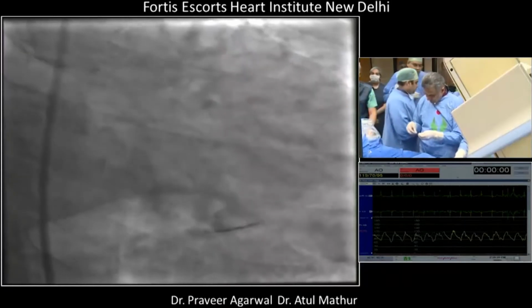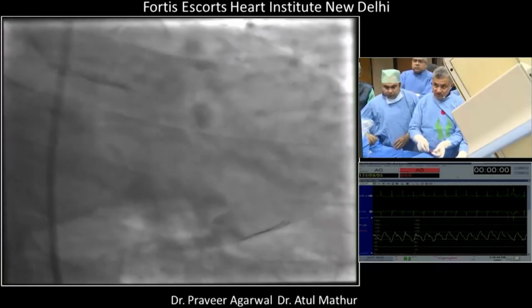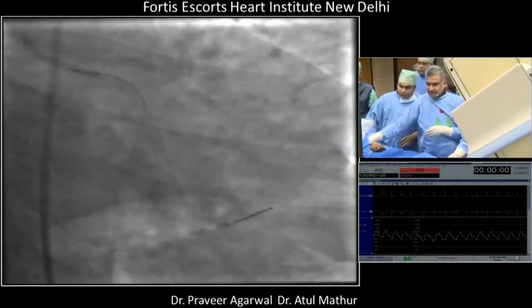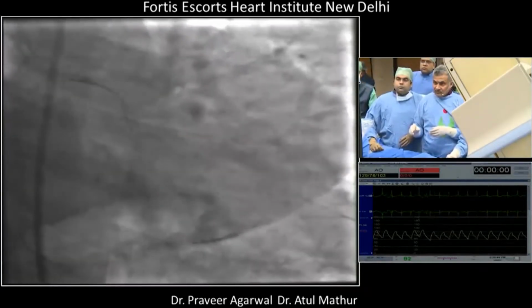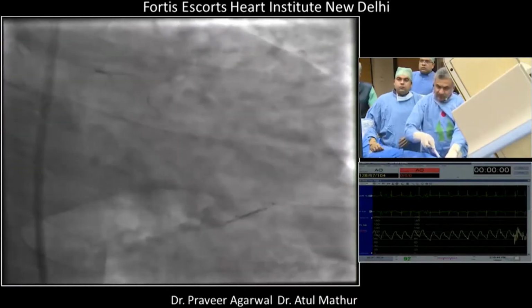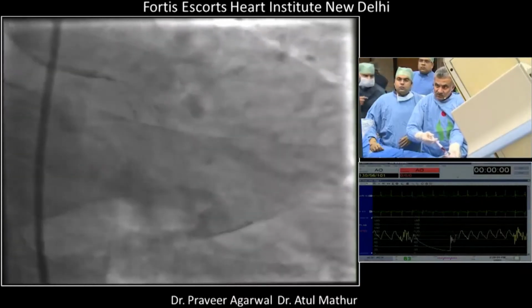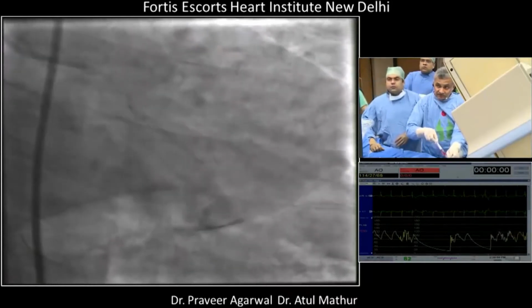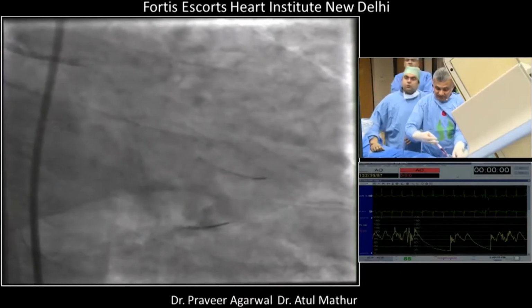Which wire is going to be used to recross the stent? All-Star. Again, All-Star. What wire do you use to recross? What wire is your choice? PT Graphics. PT Graphics. How about you? Whisper. शायद shape कम है. Fielder. Fielder XT. Fielder FC, or regular Fielder wire.